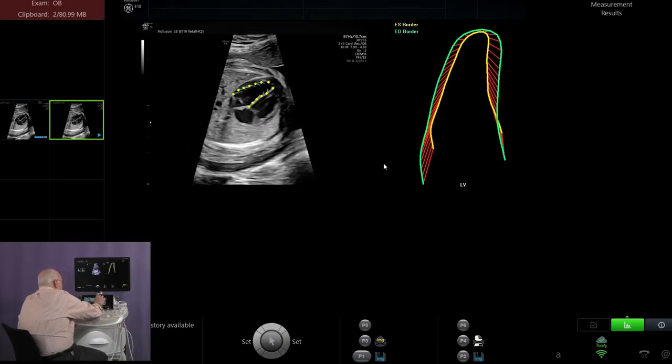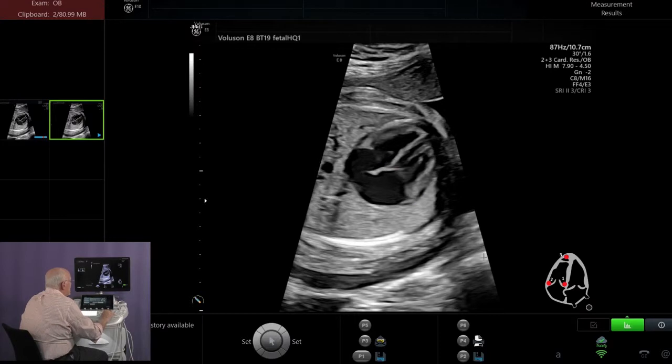We're now going to go to the right ventricle. And again, it asks us to touch the red dots at septal wall, lateral wall, apex. We'll do that right now. Here's the septal wall, here's the lateral wall, and this is the apex.